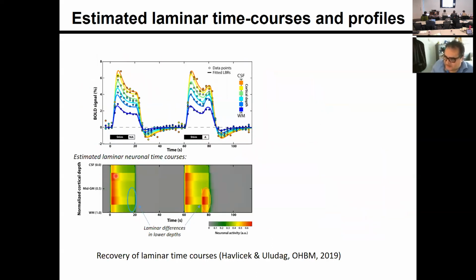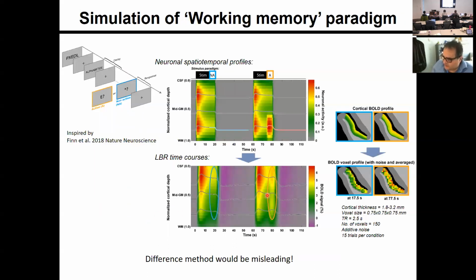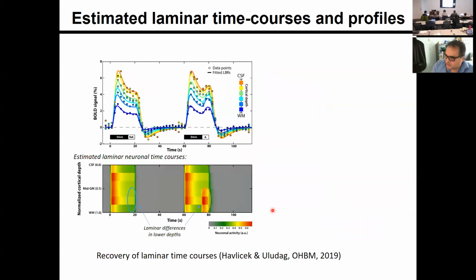What you see is we see the two peaks, so that's good. But more importantly, we recover the peak in the bottom layer, which if you look at the original data we used for spatial deconvolution, there was only a peak in the top layer and some distribution here and some small peak here. So we recover the peak in the top layer and the bottom layer.